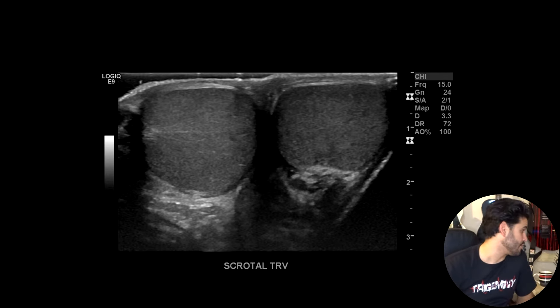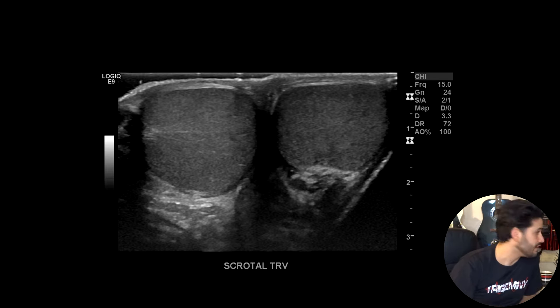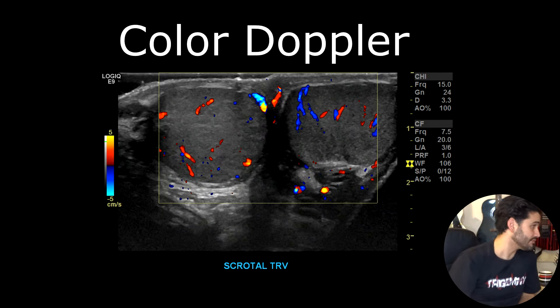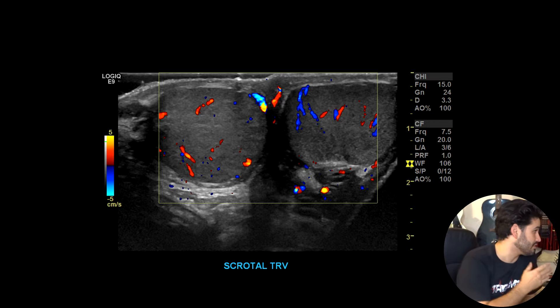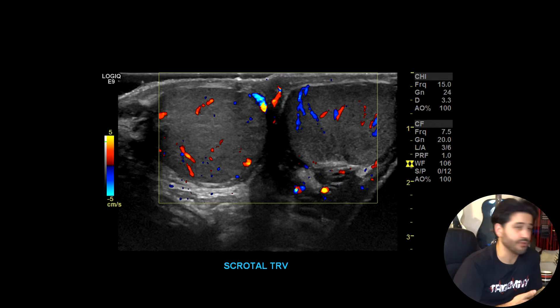To begin, we're going to go transverse with what I call the twins view — that's both testicles in the same image, transverse. That's a good way to look at both testicles, make sure they're both the same in echotexture and echogenicity. Make sure there's no fluid around either of them, and that they're both lying transverse in the scrotum. After you've taken that image, you want to throw on color doppler. This is a good way to rule out testicular torsion right off the bat. Here you can see in both images there's equal flow to both testicles — pretty symmetric. There's no hyperemia in one or the other, which would potentially indicate orchitis or some other inflammatory process.